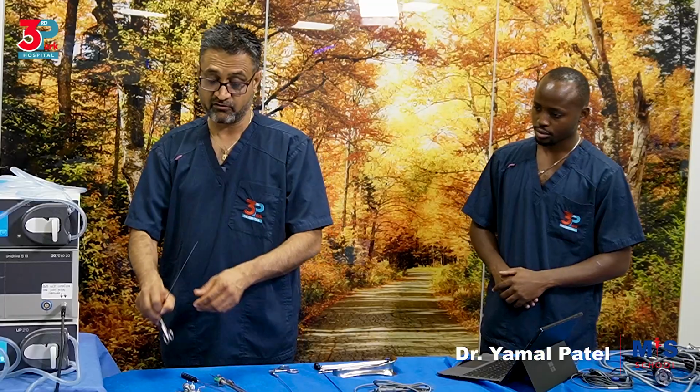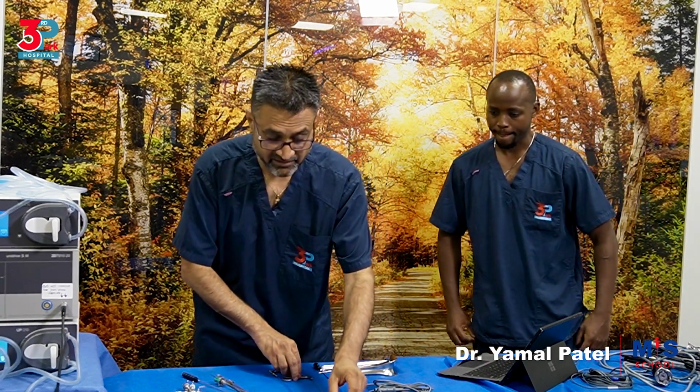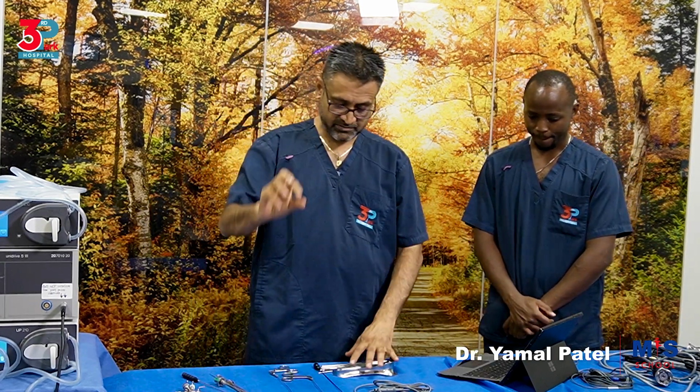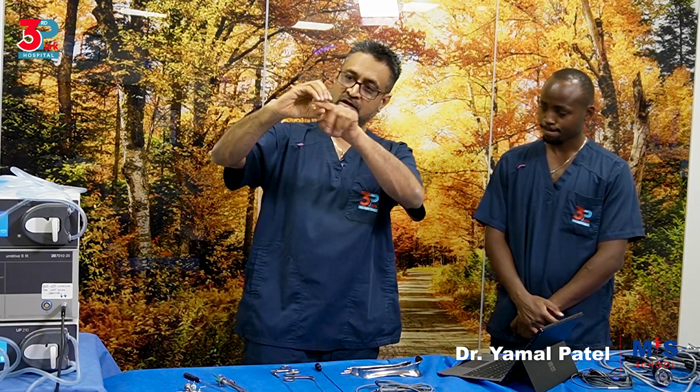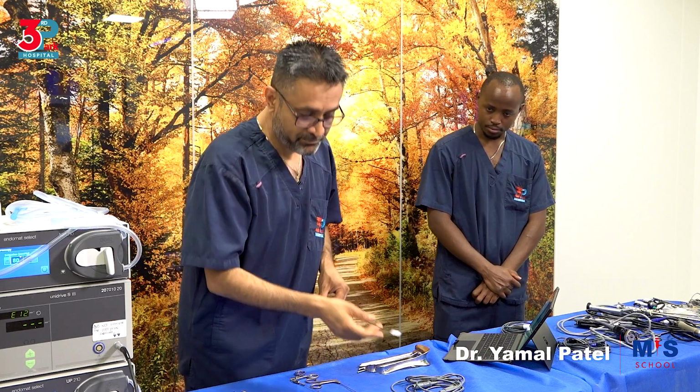Then you have a grasper. We have a grasper that can be used to grasp. We have a biopsy forceps that has a spoon-like end so that you can take a biopsy, let's say while assessing postmenopausal bleeding or something suspicious. You have a bipolar needle.